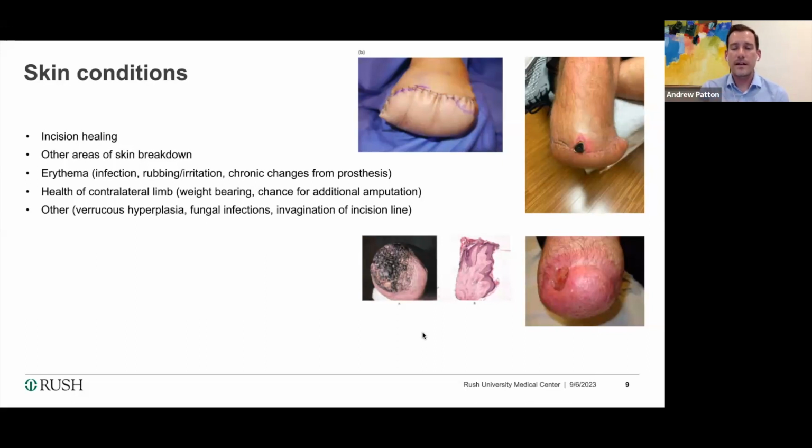It can happen spontaneously, but a lot of times it actually happens from too much suction at the end of the prosthesis. They're not fitting in their prosthesis very well, so there becomes a vacuum space between them and the bottom of their socket, and it ends up sucking on the bottom of their residual limb chronically, and that causes hyperplasia to start. So, Wolff's law: tissues react to the stresses placed upon them. They start forming these warts, hyperplastic in that area, because it's constantly having that suction on it, and it can turn into a bigger issue if it's not taken care of.